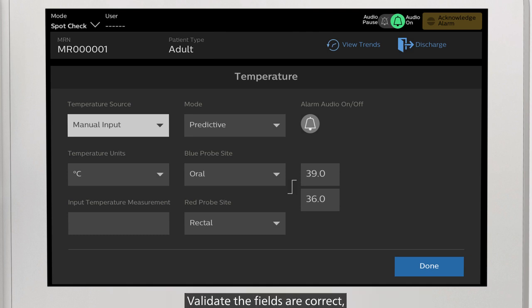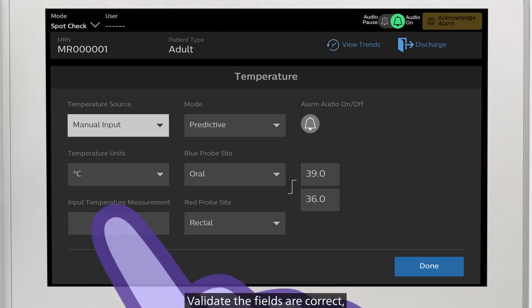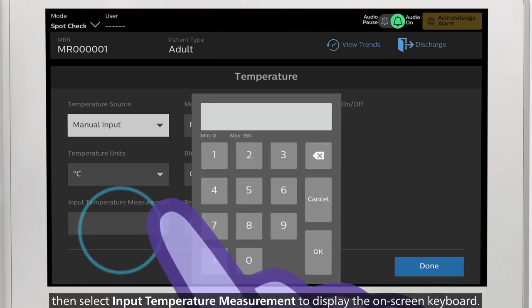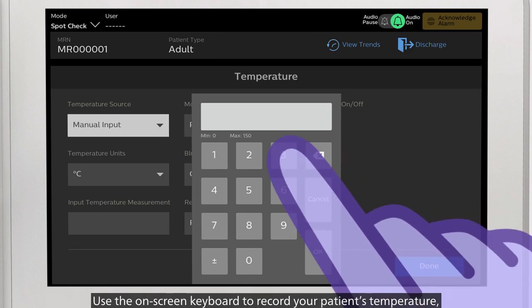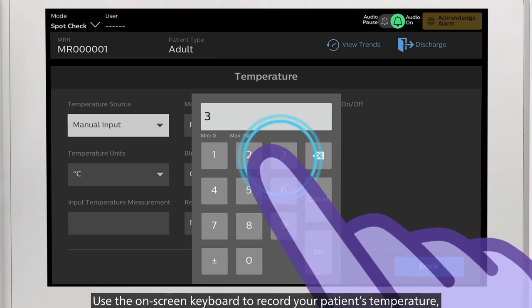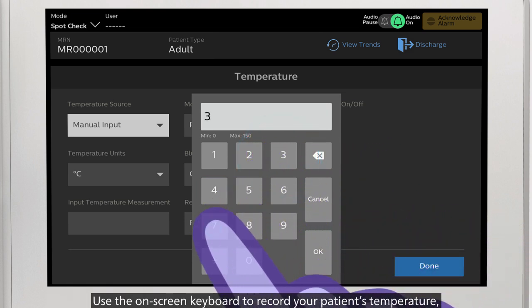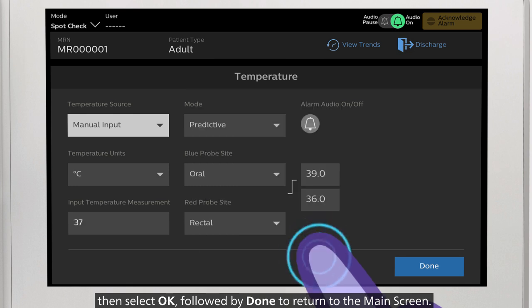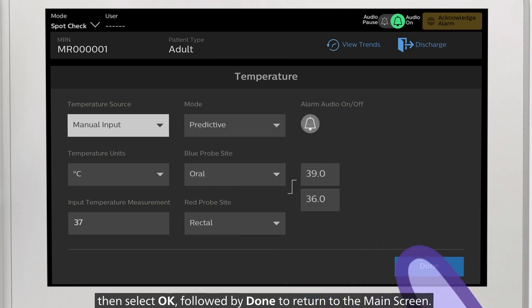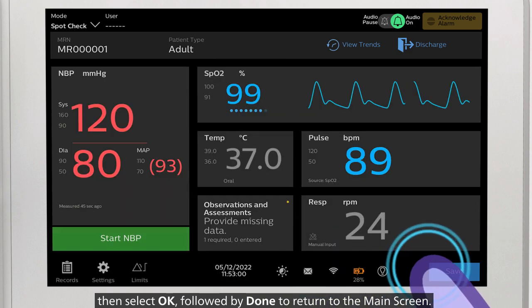Validate the fields are correct, then select input temperature measurement to display the on-screen keyboard. Use the on-screen keyboard to record your patient's temperature, then select OK followed by Done to return to the main screen.